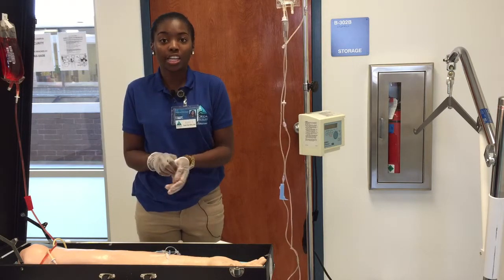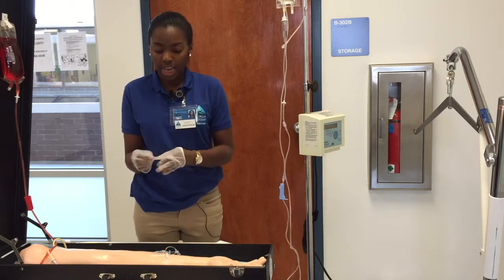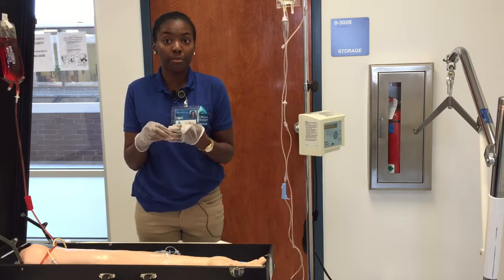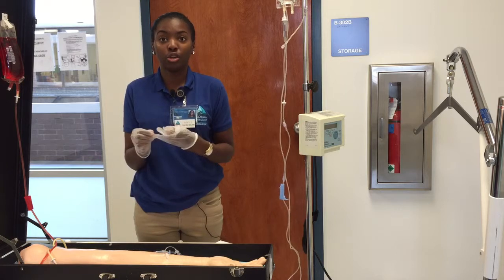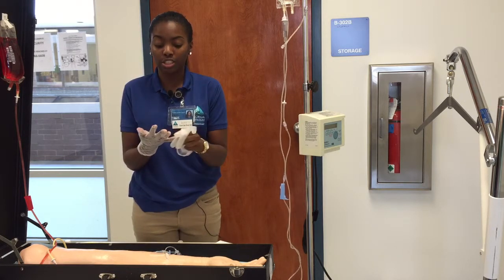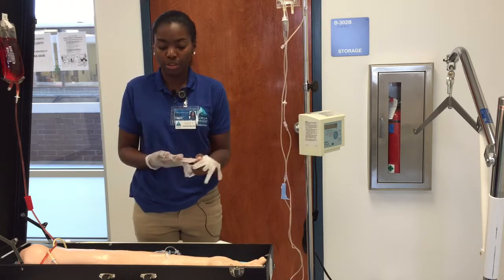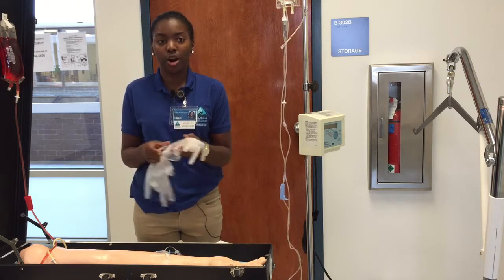and I will do hand hygiene, and I will remove my gloves, and then I would document the date and the time, using my MAR, the drug, the dosage, the route, and the condition of the IV site, and the volume used to administer the medication for the MAR and the I&O.